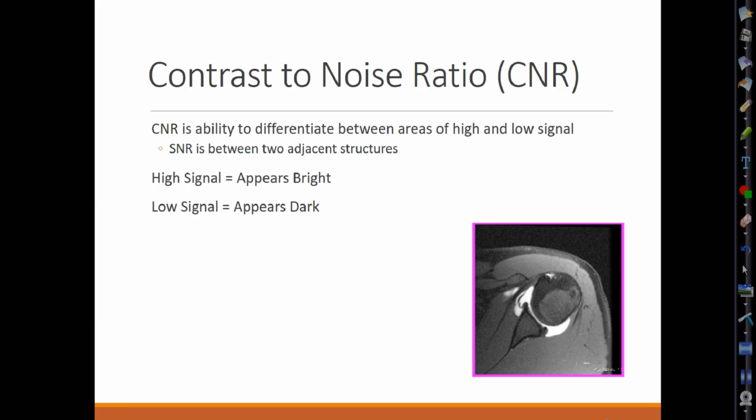Everybody's done an arthrogram in X-ray, right? You haven't done an arthrogram? You know what two body parts are most commonly arthrogrammed? Yep, hip and shoulder. Most of the time for an MRI, you guys are going to be mostly doing shoulder, but we also do hips too. You'll occasionally get a knee or a wrist, things like that.